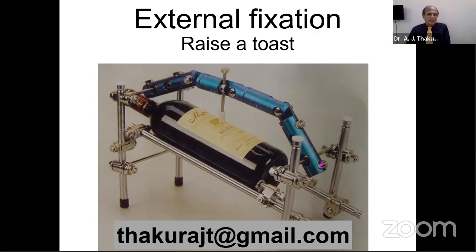If you have stopped for a very long time, then the whole process has stopped, stabilized, and starting distraction is not going to work. Then you will have to do the entire procedure again, because all these methods, all these movements, the reactions in the body are time bound. There is no indefinite time that the bone healing unit will keep on working. It works for a while and then it stops. So if for some reason you have stopped distracting, then you have to start all over again. Maybe do the corticotomy again, start the waiting period and then start all those things.